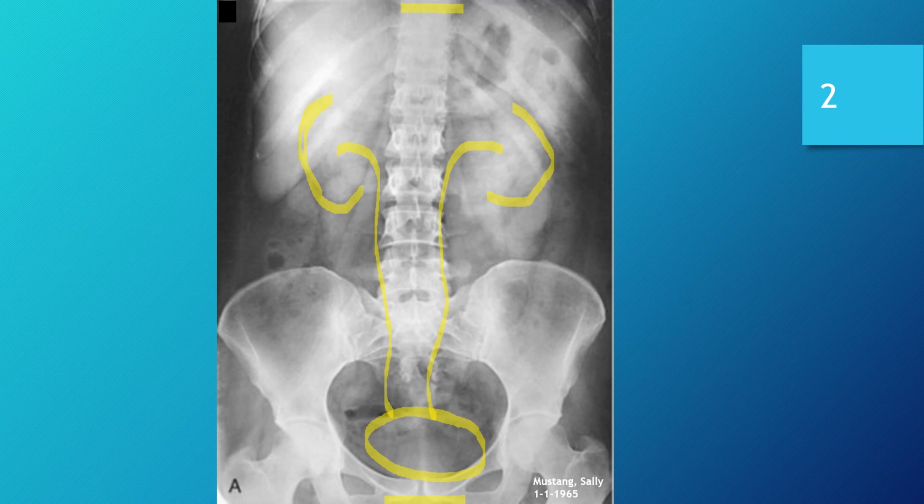Moving on, is the anatomy properly positioned? Well, we'll throw our lines up there like we did with the chest x-ray and see how that works out for us. Let's see. That one wasn't very straight, but we get the idea. So from the mid-sagittal sense, yes, this image is absolutely aligned properly to the IR.